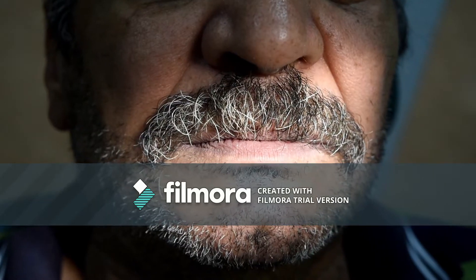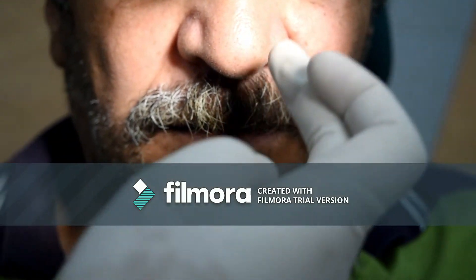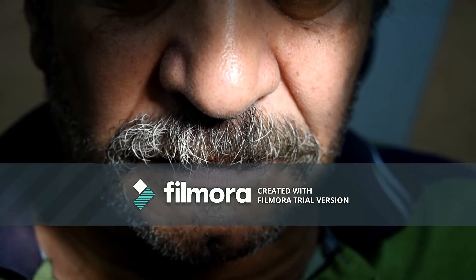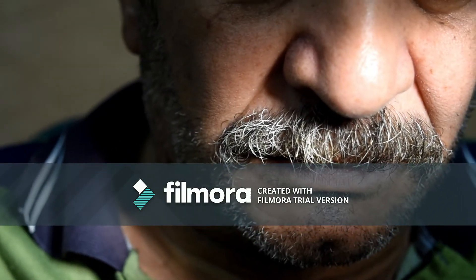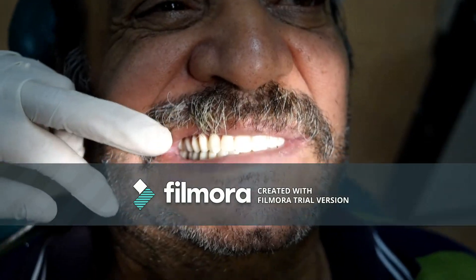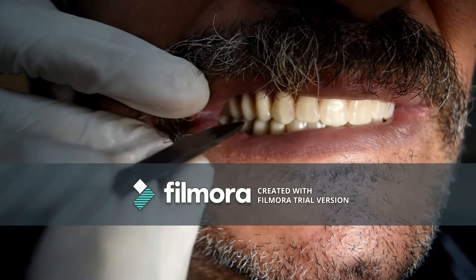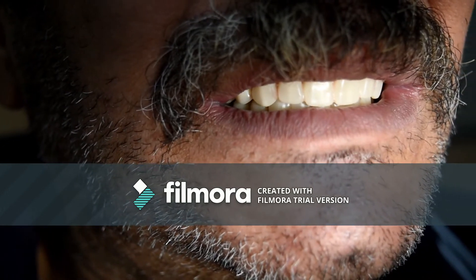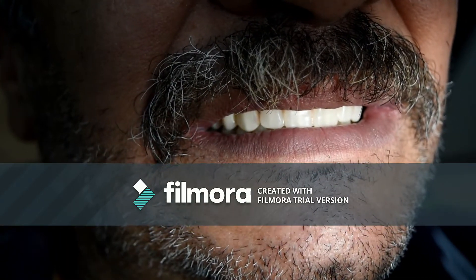After that, we can check the aesthetics of the patient. The vermilion border should be visible, the nasolabial sulcus should not be distorted, the filtrum should also not be distorted, and the corners of the mouth should be supported. The fourth method to check even bearing is to insert a knife at the premolar-molar area while the patient is biting in centric occlusion. If the knife can be inserted, this indicates a gross discrepancy in occlusal pressure, and at that point the centric relation record has to be repeated.